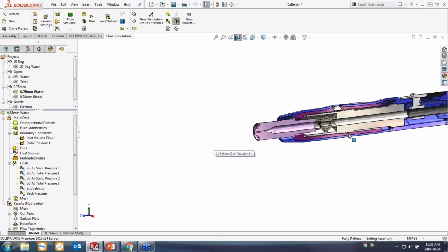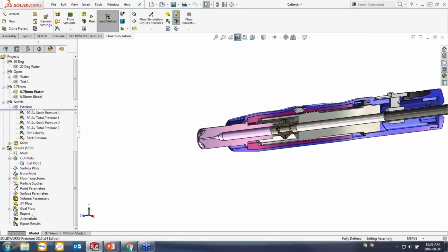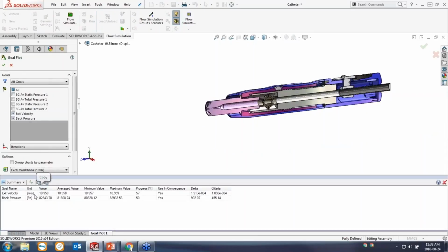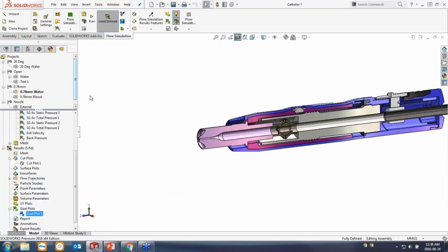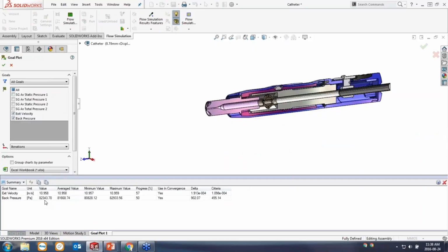Again, it was the exact same setup, run through my parametric study, run the analysis, and now if I go and take a look at my goal plot, track those two values, my exit velocity and my back pressure, I can see the exit velocity is below 20 meters per second. That's great. And my back pressure, it's down below 100,000, which is perfect. It was a little bit lower, you probably saw, than the 91,000 that we got out of the parametric study. And that's because I rounded.